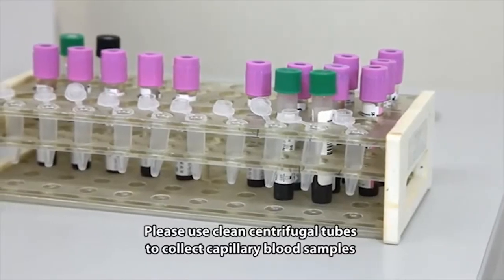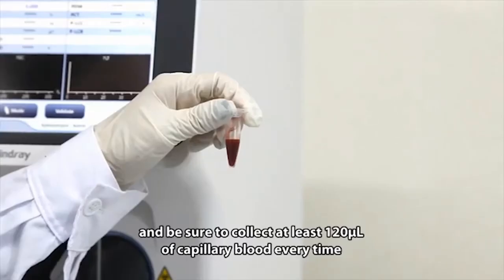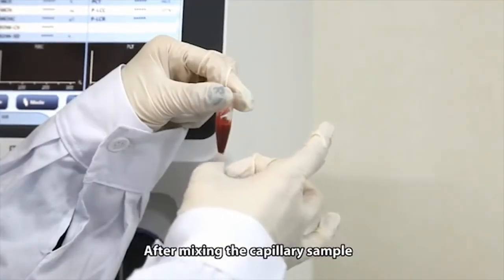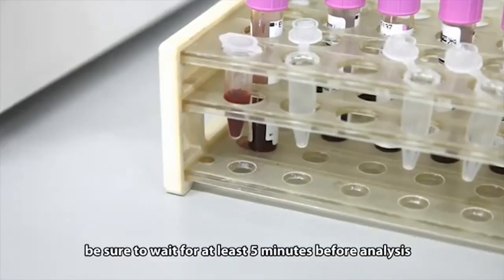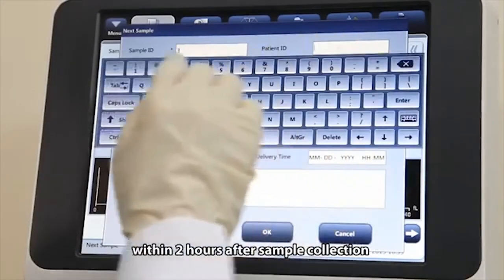Please use clean centrifugal tubes to collect capillary blood samples, and be sure to collect at least 120 microliters of capillary blood every time. After mixing the capillary sample, be sure to wait for at least 5 minutes before analysis, and you must complete the analysis within 2 hours after sample collection.